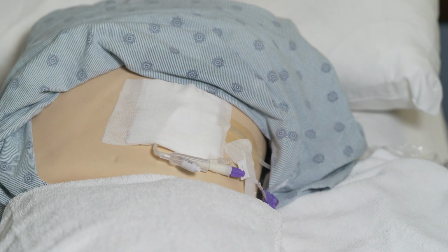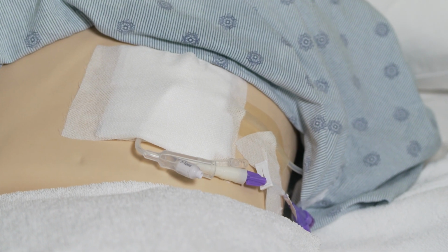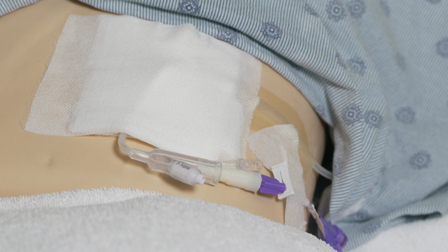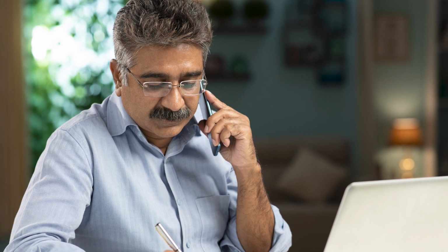It is normal to have some drainage around the J-tube site. If there is drainage, it is important to change the dressing often to keep the skin dry, prevent skin irritation, and site infections. If you need to change the dressing several times, contact a member of your care team or your doctor. They can suggest other options to help protect the skin and limit the number of dressing changes.